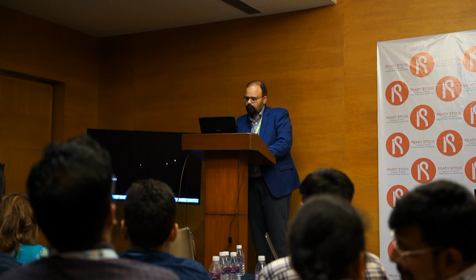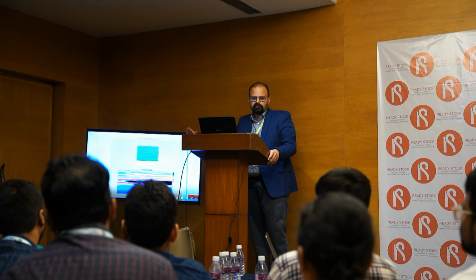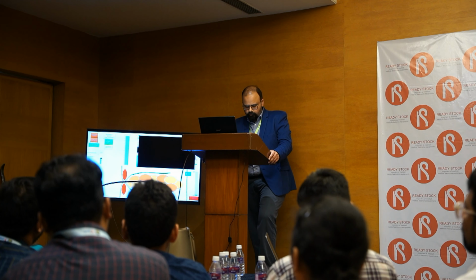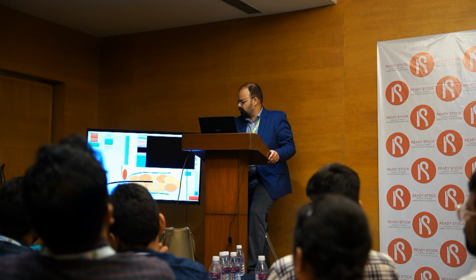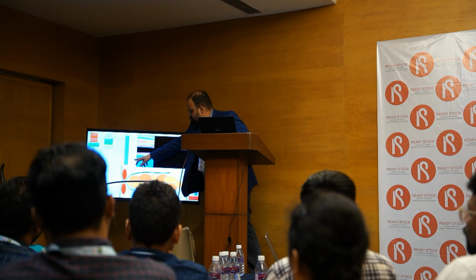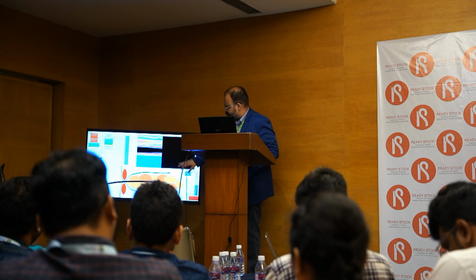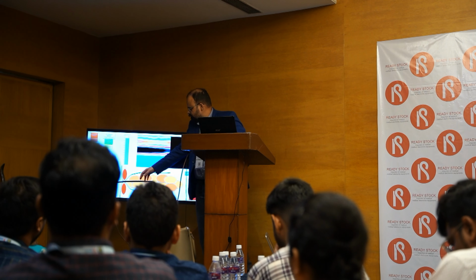Squeeze training video. Okay, so when you begin, you will have this kind of an image. You can choose which you want to do. In the first course, start with the squeeze training first. You will have this kind of an image on your screens. You have the anal pressures here, you have your live recording here, and one diagram to tell the patient the basic anatomy.